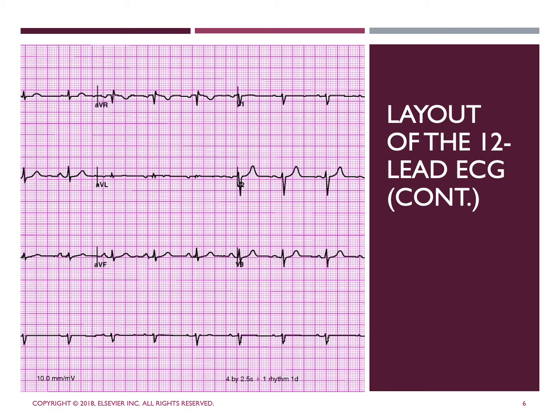What you see here, as far as this picture on the slide, is an example of a 12 lead electrocardiogram or ECG. And what you'll see is that 4-column format used on the majority of the page. We're seeing a continuous recording of lead V1 shown at the bottom of the page.